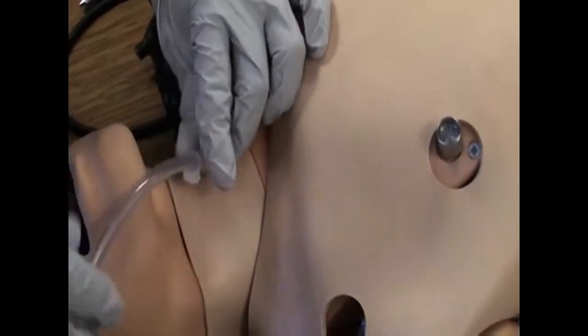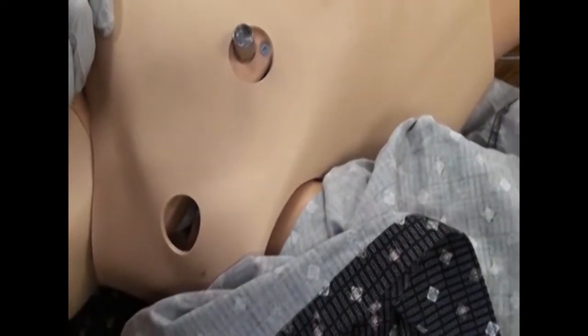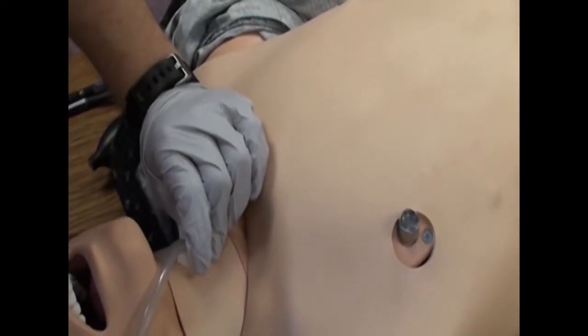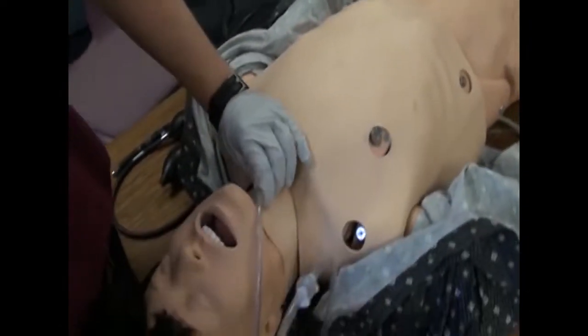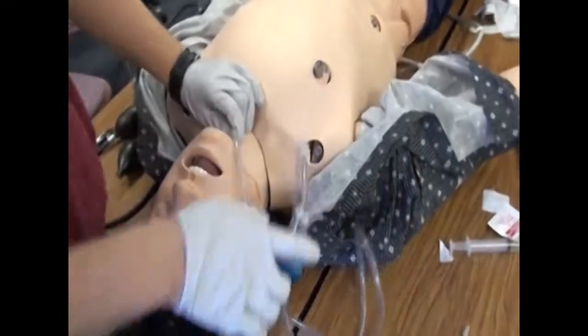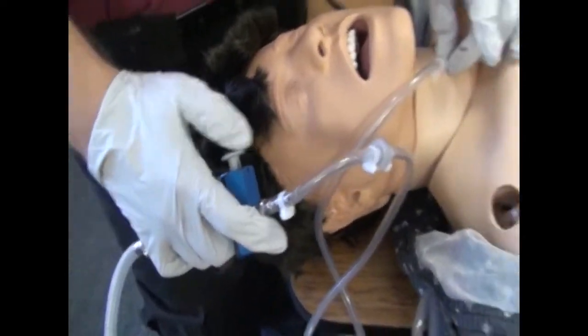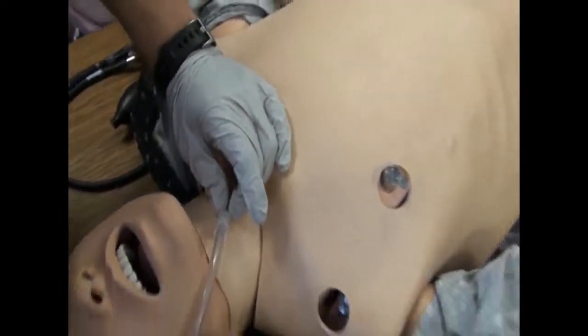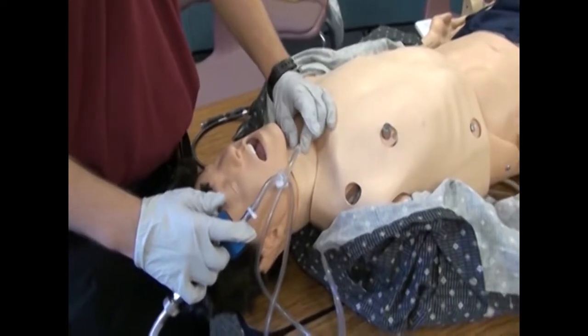Presses the inflation valve and assesses for chest rise. Watches for chest fall. Continues to ventilate. Verifies adequate expansion.